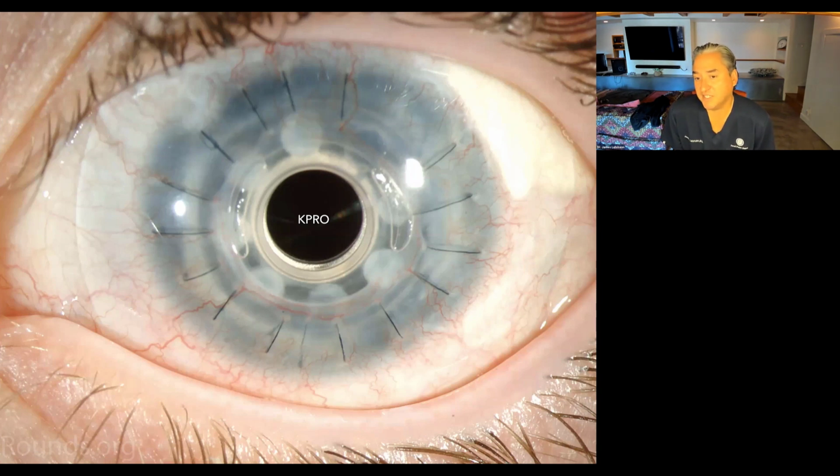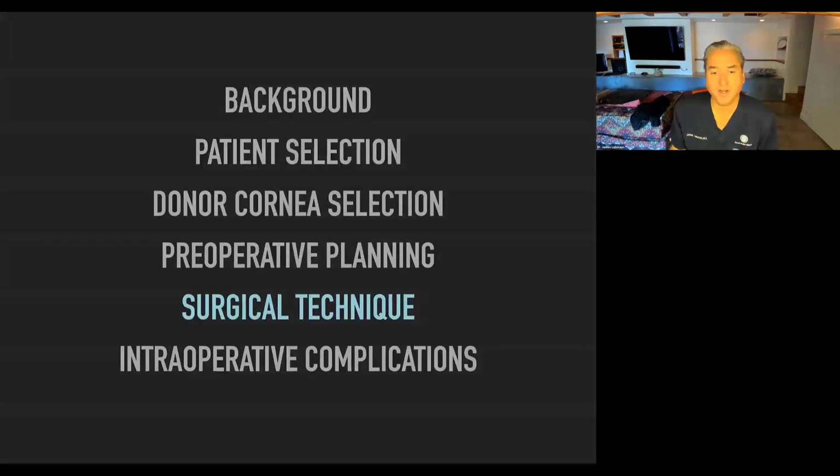For example, when I visited Jerusalem to St. John's Eye Hospital, the anesthesiologists do the blocks there as well. However, in certain situations, the residents or the surgeons themselves are going to do the blocks. So I think it's whoever's the best at them and whoever's the most comfortable in terms of the relationship with the surgeon. All right, let's get to the fun part.